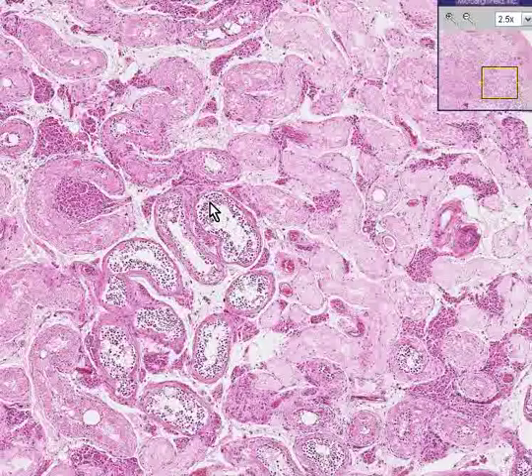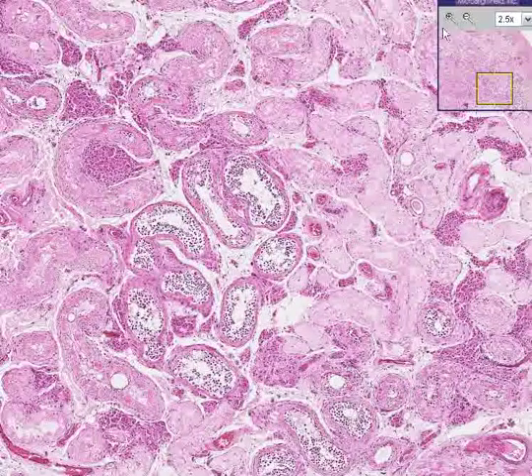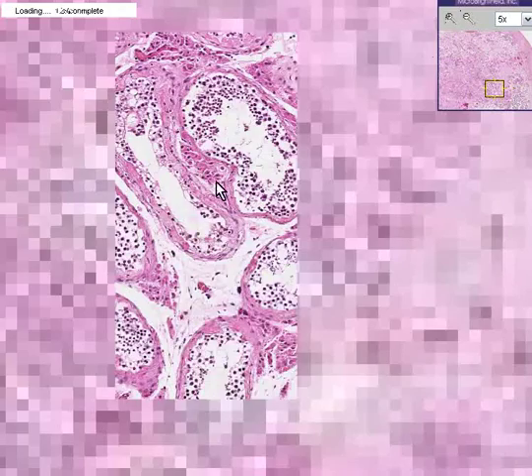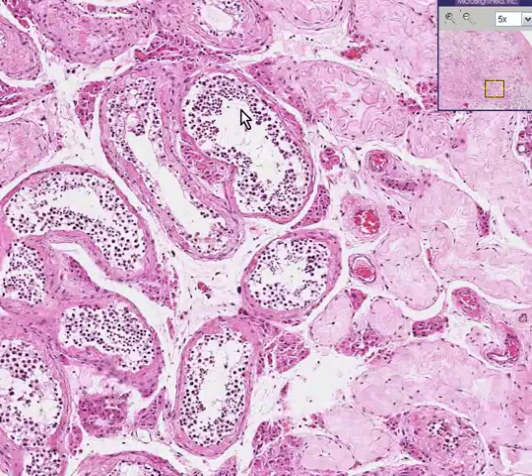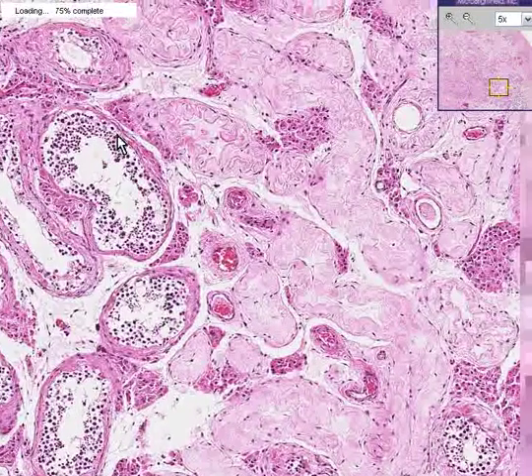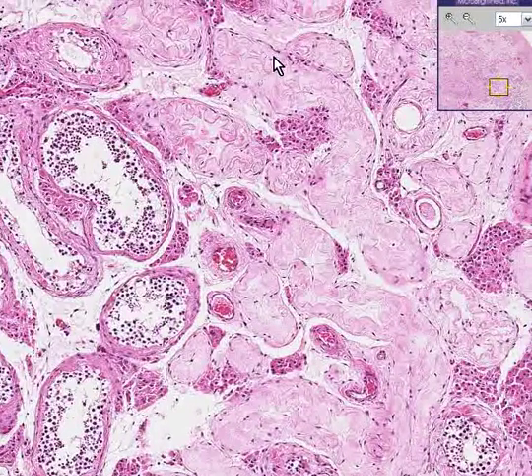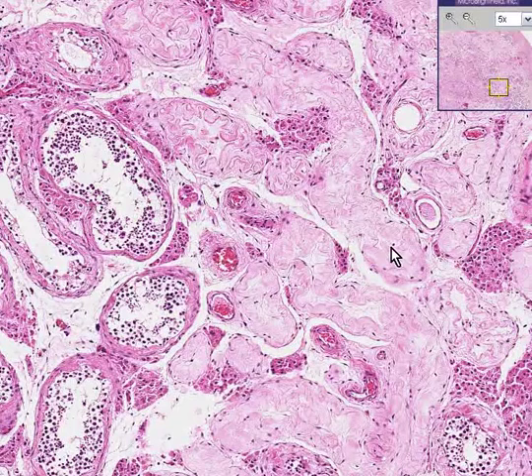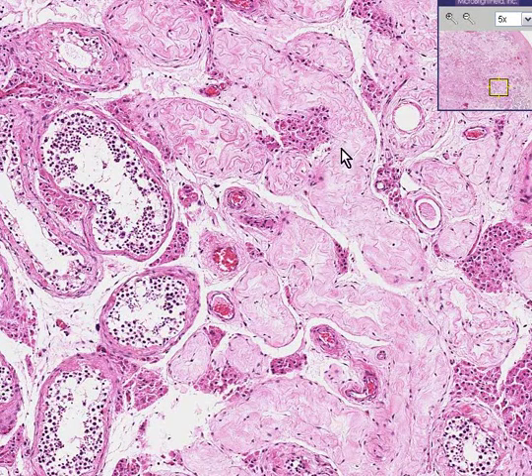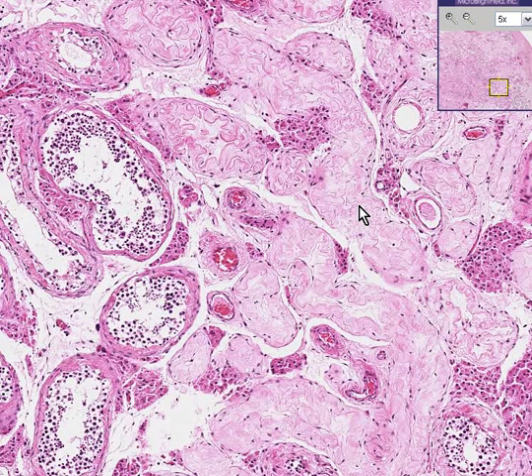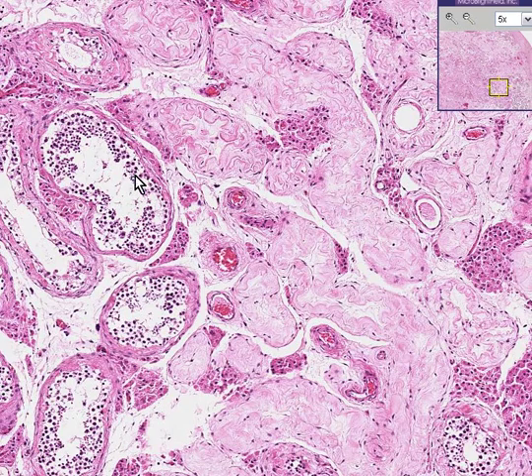Some of these tubules are filled with nice, crisp cells, and many, if not the majority of tubules, look like they don't have any texture to them at all. It looks like they are hyalinized, just like we saw hyalinized islets and hyalinized glomeruli.